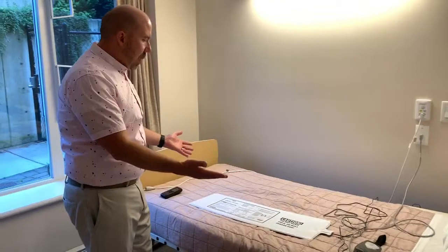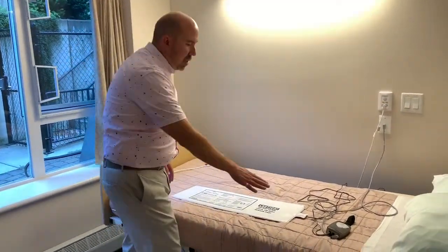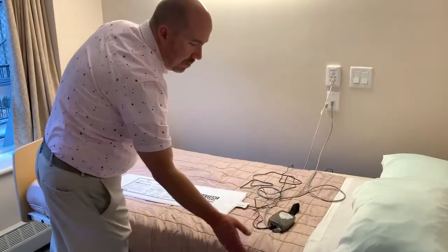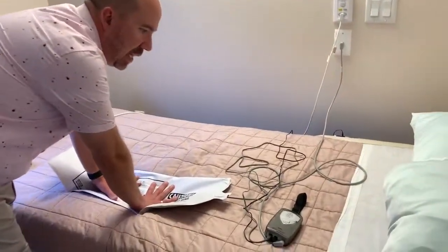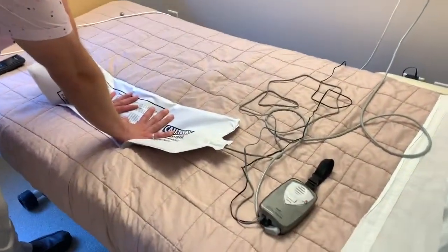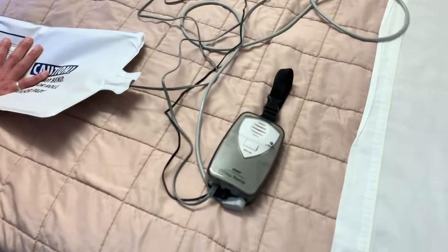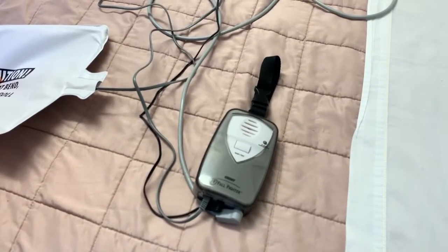So I'm going to show what happens when you sit a resident down, you lay them down. Of course, the bed controller will probably be hanging somewhere else. We're going to put our weight on there, and you're going to get a little beep confirmation like that. The beep confirmation lets you know that the device sensed the resident's weight on it, and the light's going to be blinking there just to show you that somebody's on there.